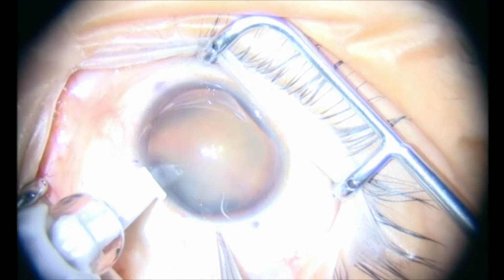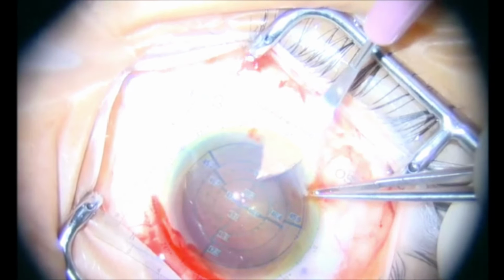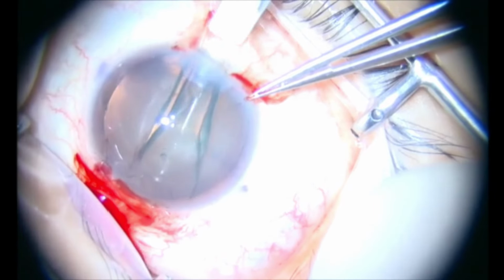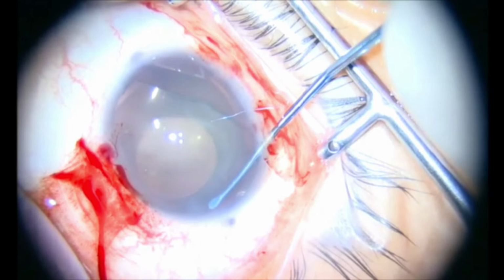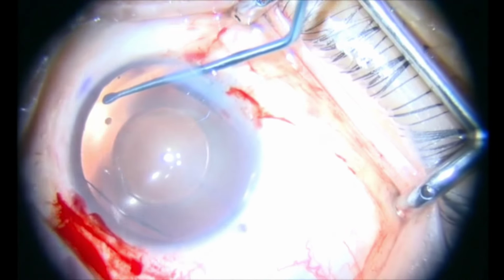In this video, Dr. George Lang implants the STAAR ICL phakic intraocular lens. A clear corneal incision is made, the anterior chamber partially filled with viscoelastic, and the lens is then implanted via an injector into the anterior chamber. The ICL footplates are then positioned under the iris using a diamond-dusted lens manipulator, taking care to avoid exerting pressure on the crystalline lens in the process. With its 4 footplates under the iris, the lens is then fully secured in the ciliary sulcus.